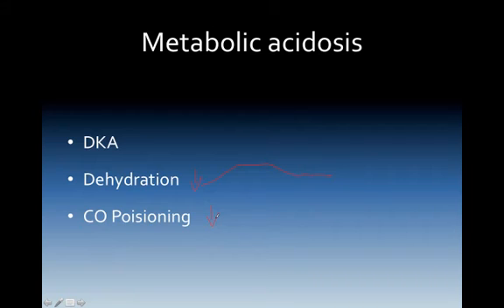At the point that they go into or start normalizing at the cellular level, and we may not be able to do this with the CO poisoning, then very simply we will start to normalize our patient. So with CO poisoning, we may see low end-tidal CO2 presentations, and then hopefully as we start correcting them, they will also rise, or they may just stay exactly the same.